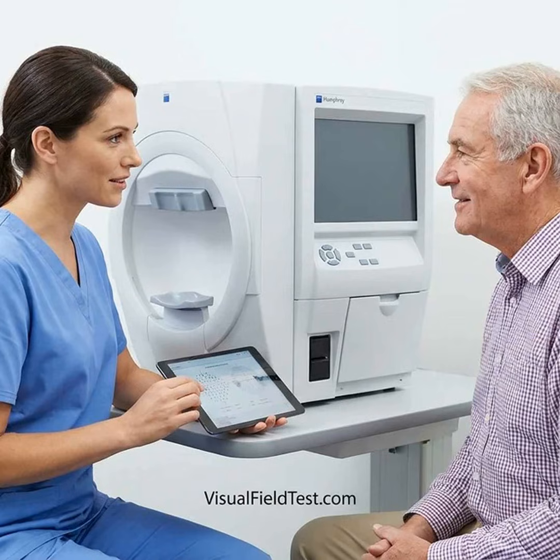What home modules do best. A home module can reinforce information before the appointment and allow repeated low-pressure exposure. Useful features include a short video, voice instructions, a simulated test, a teach-back quiz, multiple language options, captions and large text reminders, a record of completed practice sessions, feedback that emphasizes steady fixation rather than speed. However, the evidence is stronger for validated home visual field testing systems than for generic educational applications used alone.